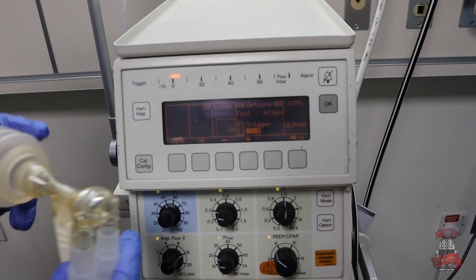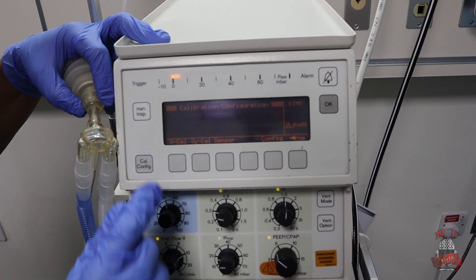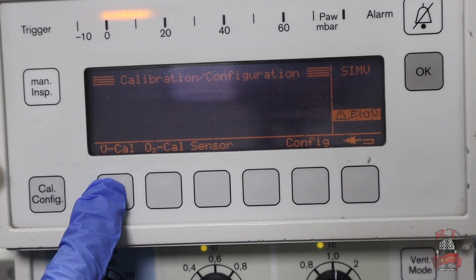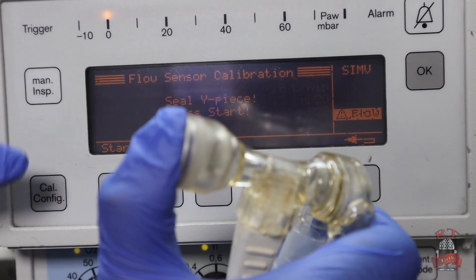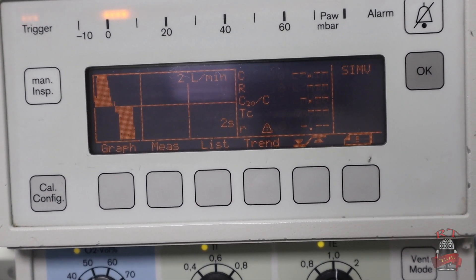Now you have to calibrate your flow sensor. You will go to the left corner to 'Cal Configuration' and press on it. After you press Cal Configuration, there is a small option written 'Sensor.' You will press on Sensor, then choose the sensor you are using — either ISO or Y. For this video we are using Y, so we press Y, then press back. You will find 'Flow Sensor Calibration.' Press on it, then seal the Y piece and press Start. I will close the flow sensor and press Start. Flow sensor calibrated — so now my flow sensor is ready.